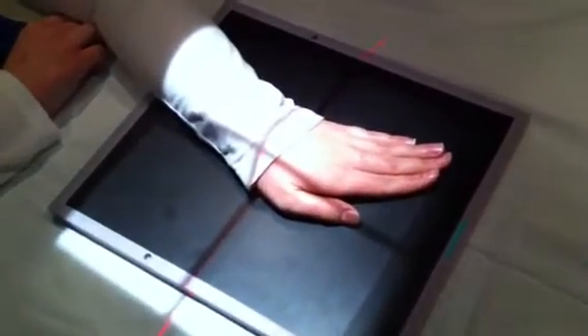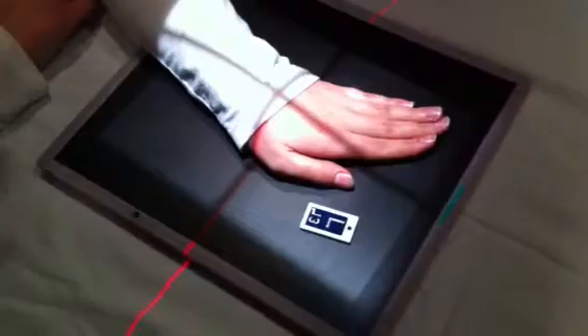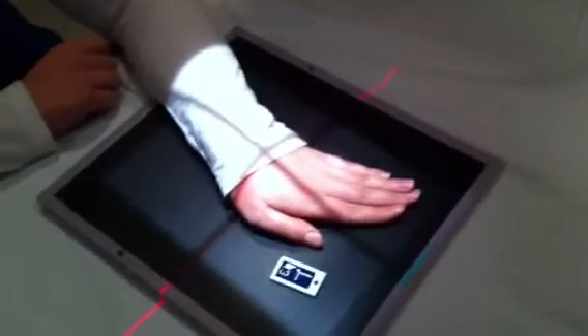It's at 40 inches, it is perpendicular, and you center over the scaphoid. I would close my collimators. Elbow's out, hand is out. This is for ulnar deviation.